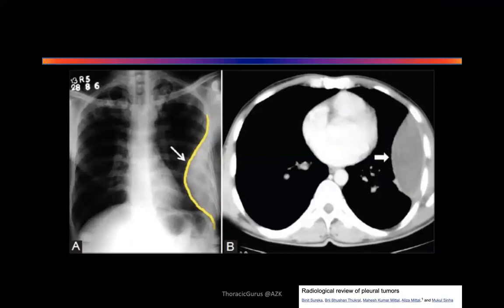Prof, this is the radiograph of chest, frontal projection. It is showing that there is a pleural cap on the left hemithorax indenting the parenchyma of the left lung. And the indentation is quite homogeneous, and the margins seem to be regular. Talk about this one.